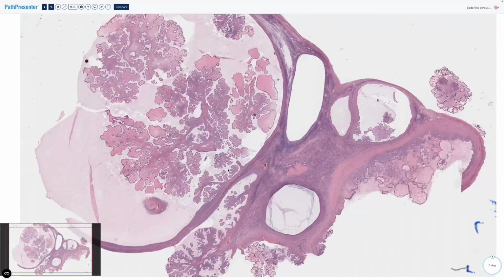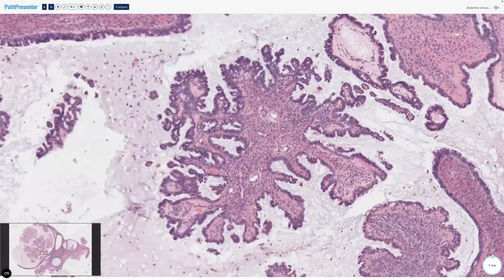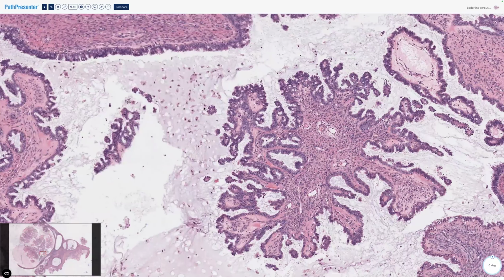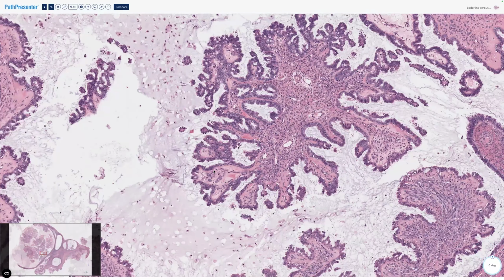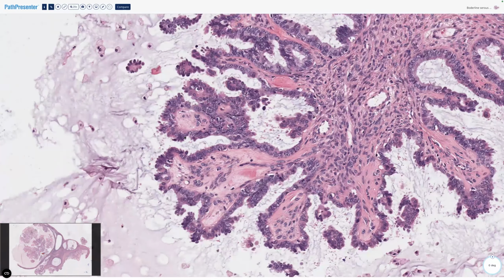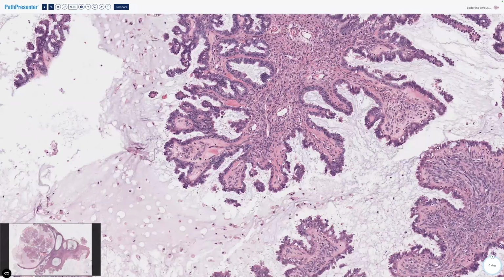Well, first we want to identify them as serous. So let's have a look. So serous tumors classically have little bits breaking off. Okay, they form these little broken off rosettes. And when we look at them, the cells are smaller and squarer than their mucinous or endometrioid counterparts, and they have cilia. And every now and again, they should have a pale intercalated cell. Okay. So this hobnail breaking off, small and square, cilia is serous.